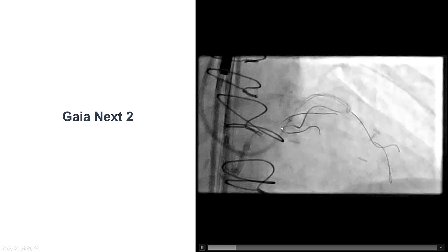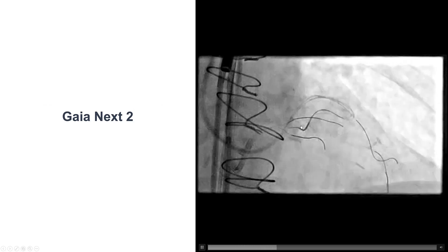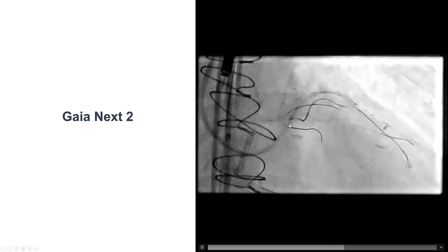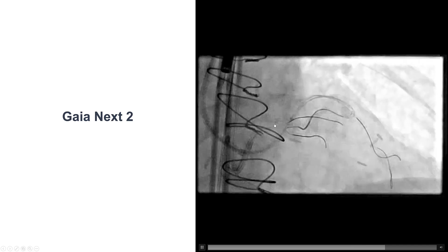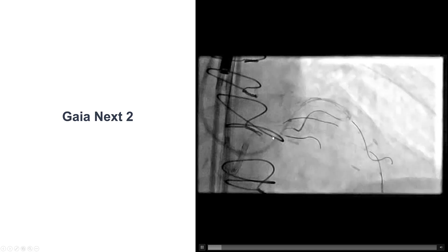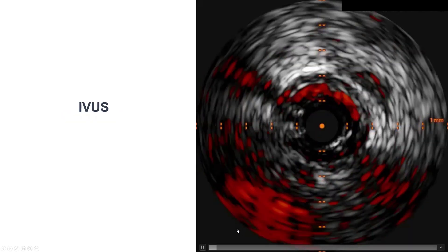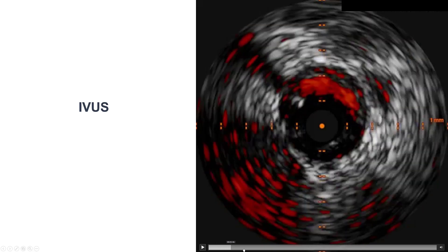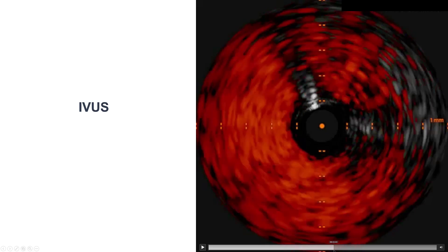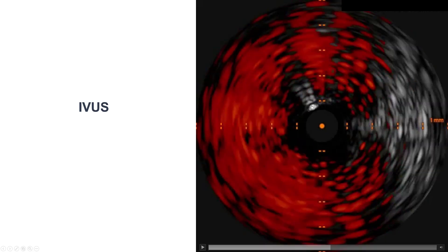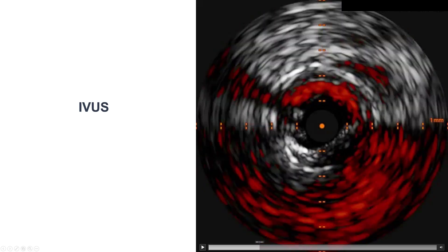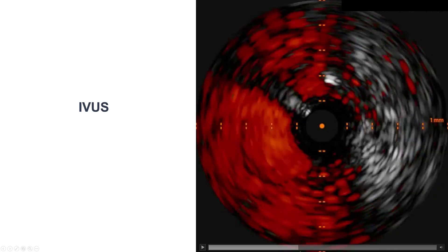We then did antegrade wire escalation with a Gaia-NX2. There was some difficulty with advancement; however, with persistent effort there was some forward movement of the guide wire. The lesion actually appeared to be shorter than we had initially thought, and we can see the wire seems to make some progress. We did intravascular ultrasound to determine whether we had crossed into the true lumen or extraplaque, which is very important in cases like this, and what was found is that actually the wire was into the true lumen, and the entry point was into the left main without extraplaque component.